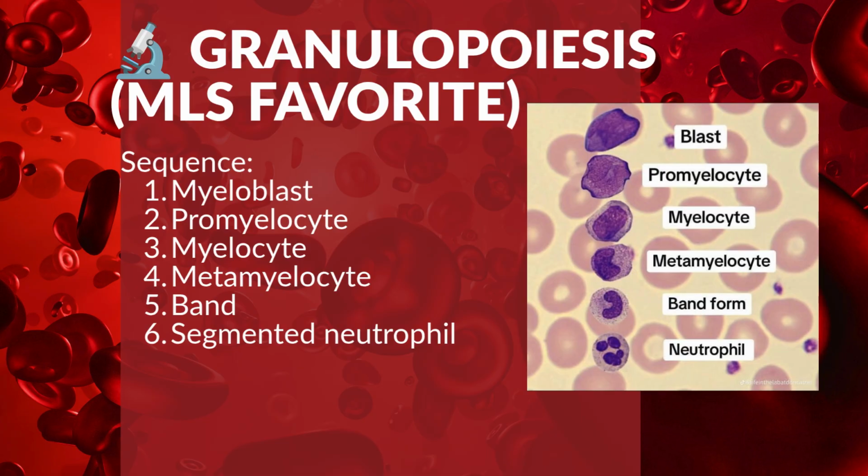All right. So here we go. This is what I was talking about here. When we're talking about the maturation sequence, it is one of the most important pathways in hematology and heavily tested in the MLS exam.